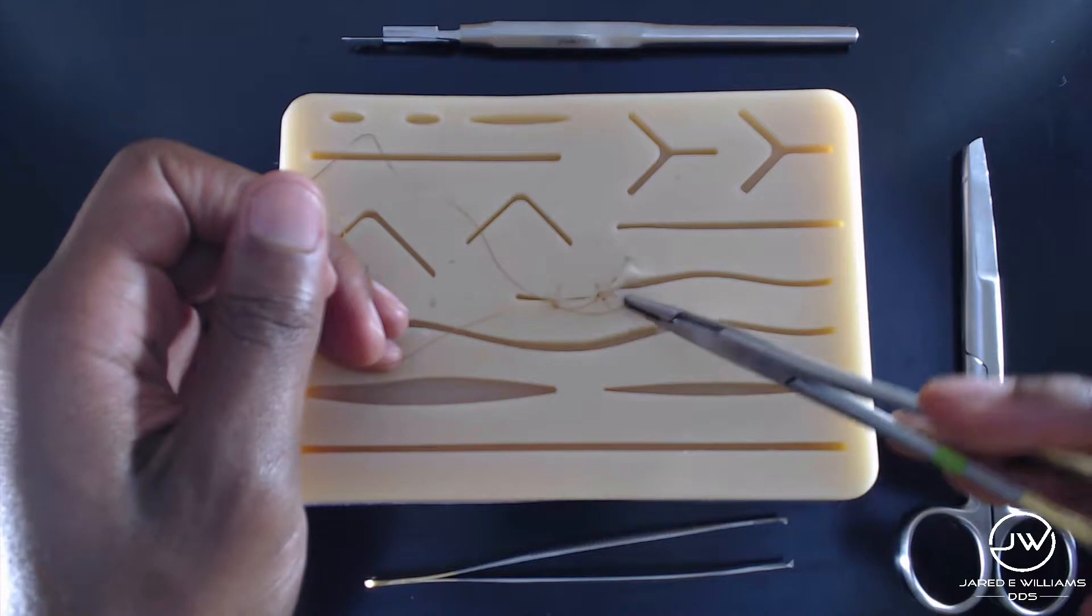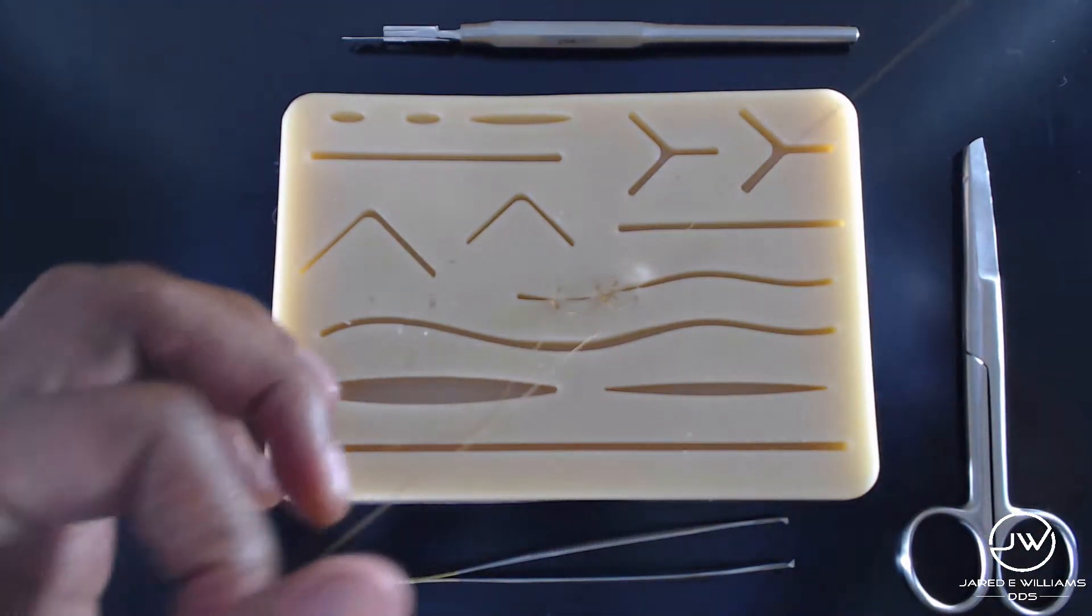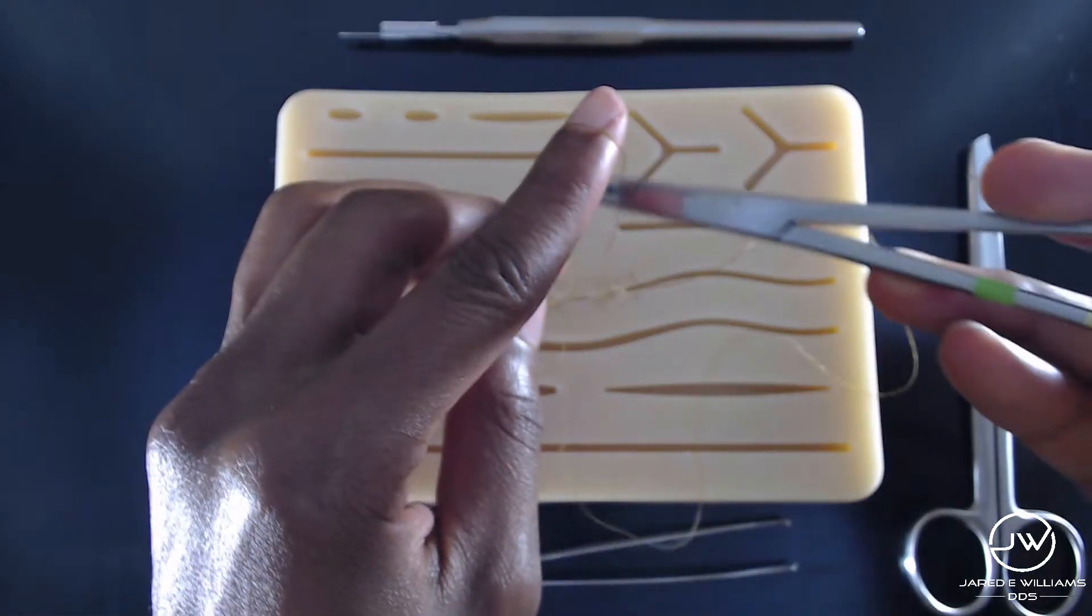Just remember, all we're doing is re-approximating tissues. Nothing more, nothing less. I'm going to create my knot going past, passing through.